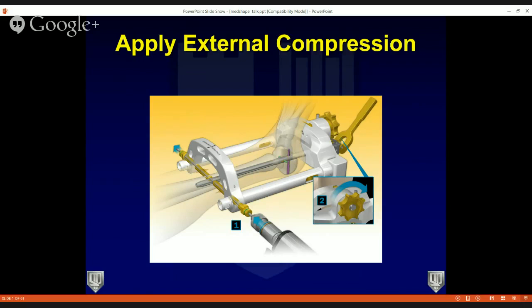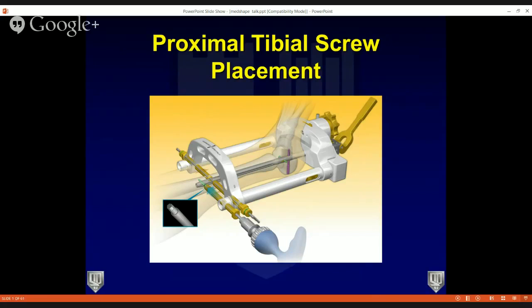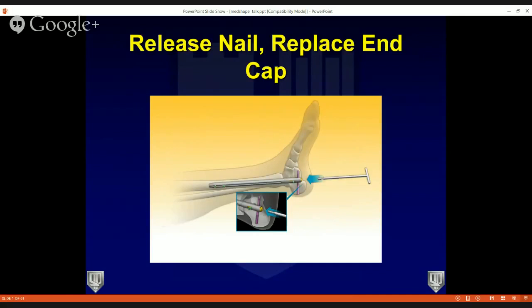Dr. Adams will talk about how much external compression we typically like. Now you are getting external compression through the TTC fusion sites — in the gradation scale, you can measure how much compression you are getting. Then go to the most proximal screw: drill under C-arm through the tibia, through the nail, and back through the tibial cortex. We then take a second larger drill bit and just drill the proximal cortex. Under power, put the screw through the tibia and through the nail, and do the same for the second tibial screw. Then release the nail and place an end cap.